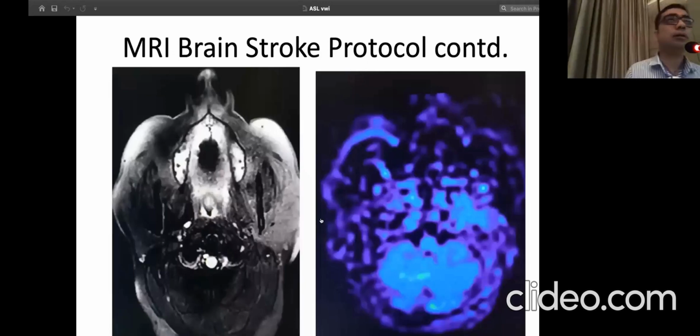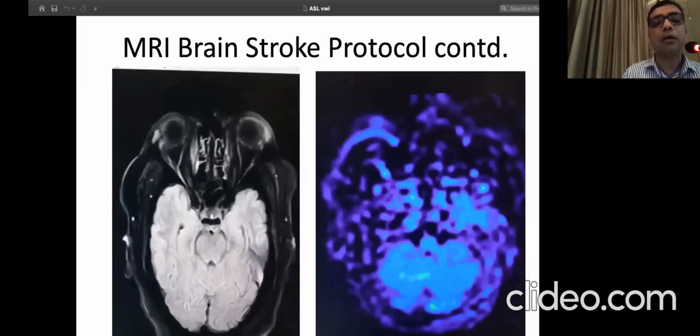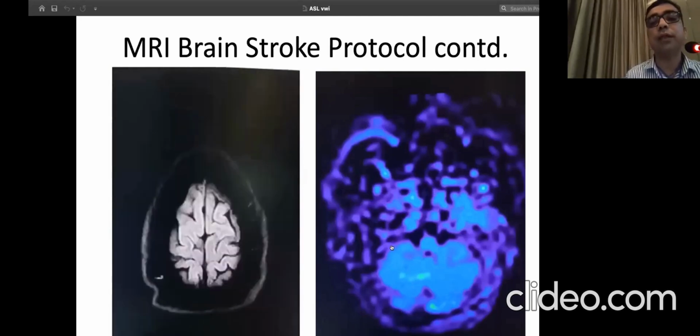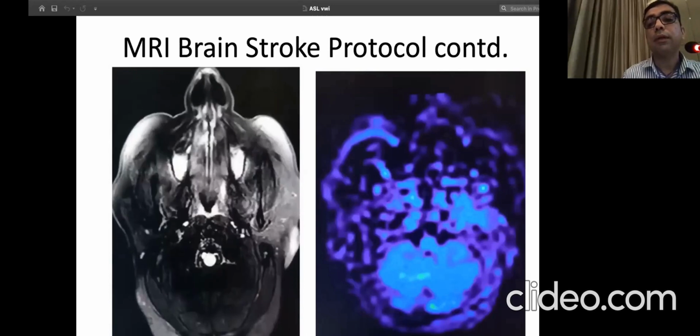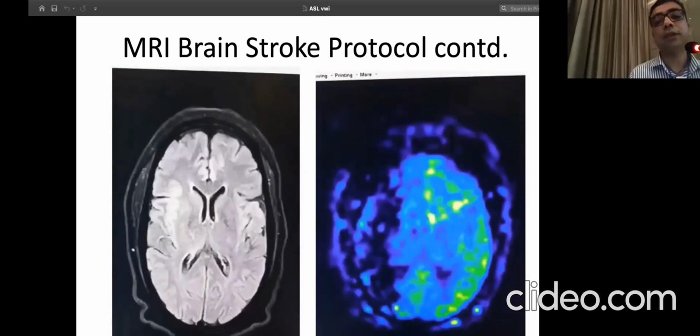Regarding the clinical aspect of this case, this was a wake-up stroke. Somebody thought it was 7 hours, somebody thought no, we had seen that guy. This was a young guy, last seen time was uncertain, so nobody was sure. When we got a FLAIR, this patient landed early in the morning, and the FLAIR was not showing much of a change. So there was a FLAIR diffusion mismatch. Then we also did the ASL, and the ASL was showing a significant deficit there.